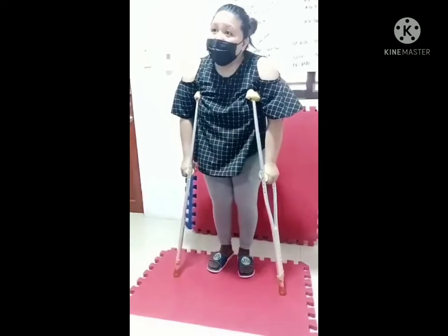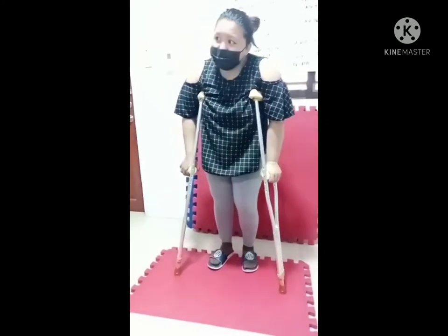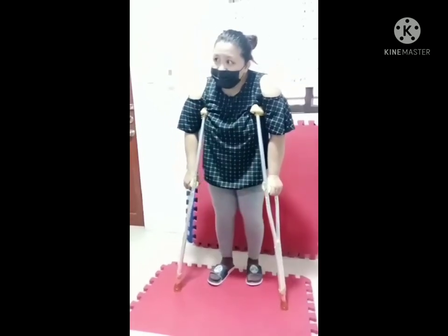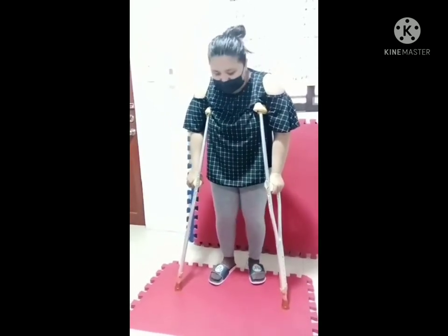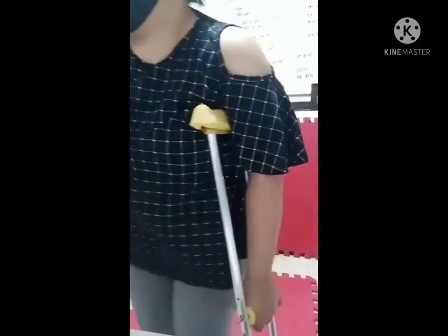Let's start with the two-point gait using a contralateral pattern. If my bad leg is the left, I start with the right crutch. One, two. One, two.